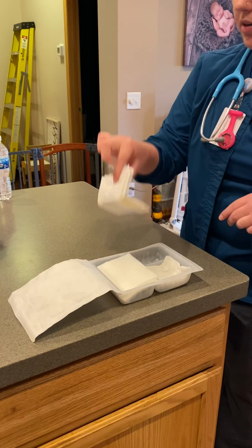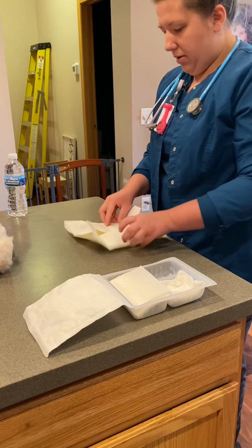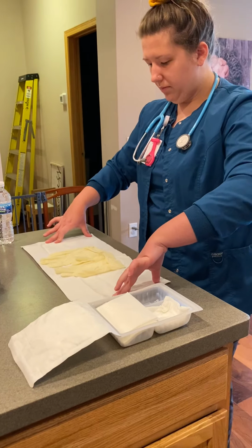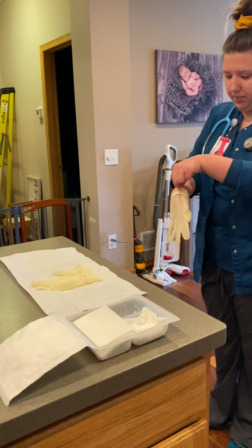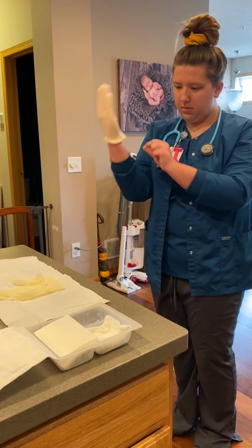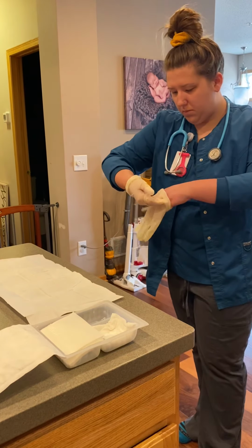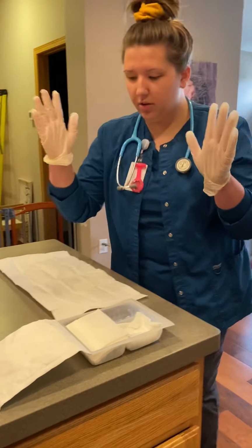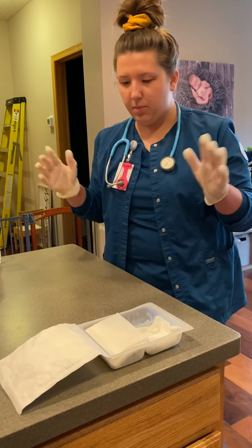So I'm going to take out my sterile gloves, put them to the side. Stepping away.